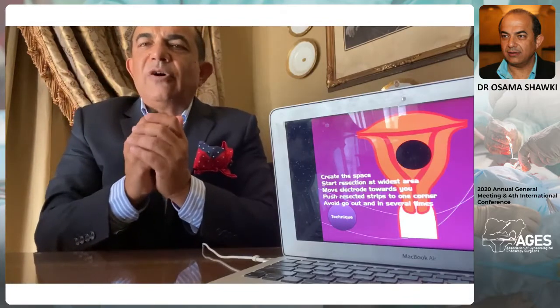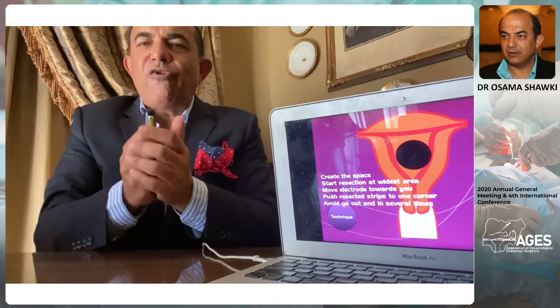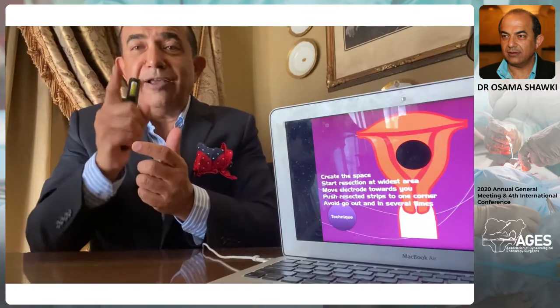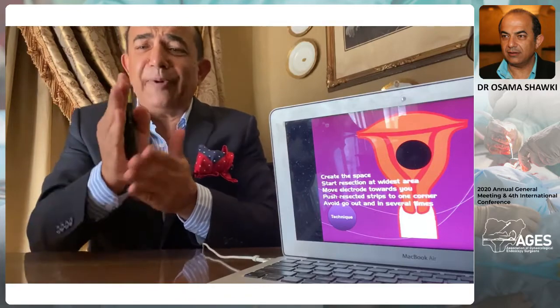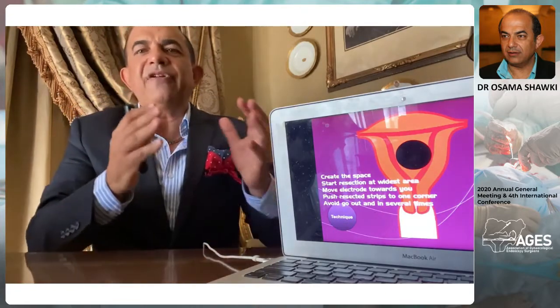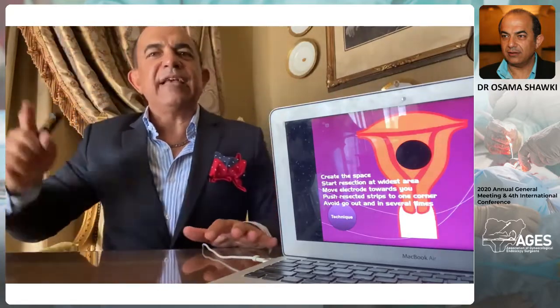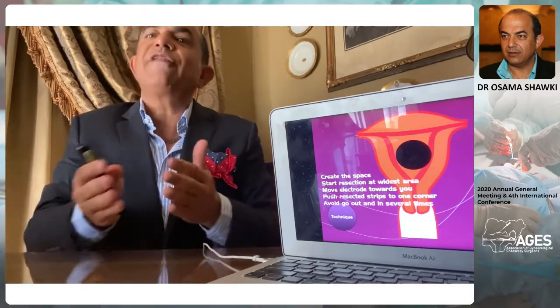So here, this again highlights the value, the need, the demand for achieving proper pressure. I'm not saying high, because when you say high pressure, people call me crazy and they attack me, okay? I'm saying the proper pressure just to separate the walls. How much of this? Impossible to tell, because there is a leakage from the cervix and there is a variation in the size of the uterus. So it's not like laparoscopy, where you can say a pressure of 15 is enough to insufflate the belly. Here it's very variable because of the variables in the leakage and in the size of the uterus.